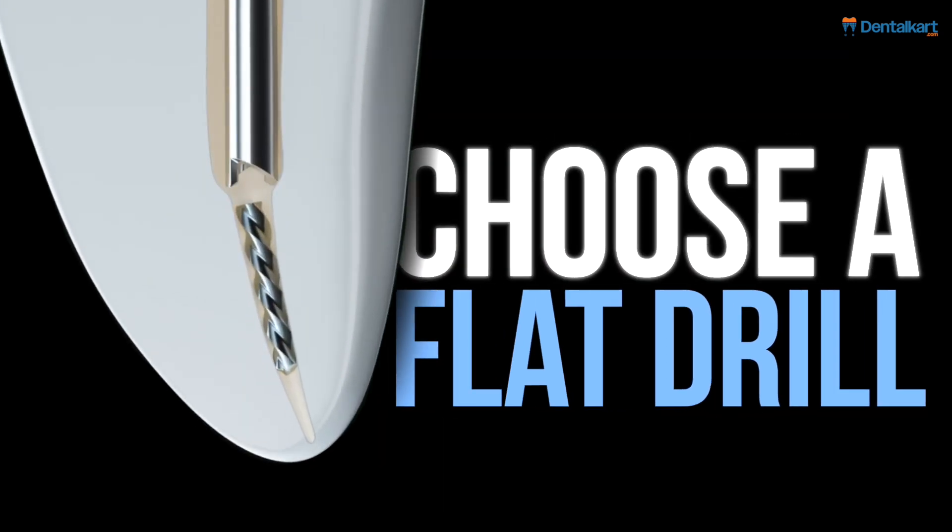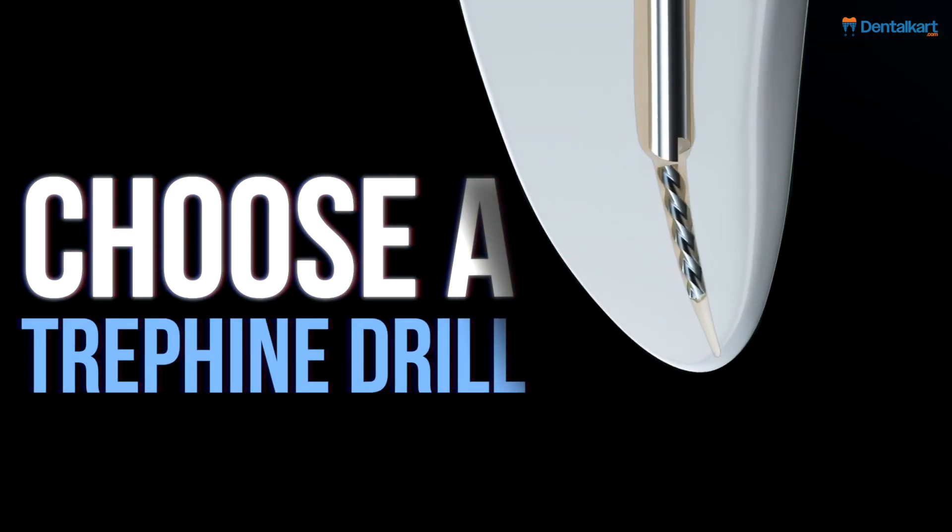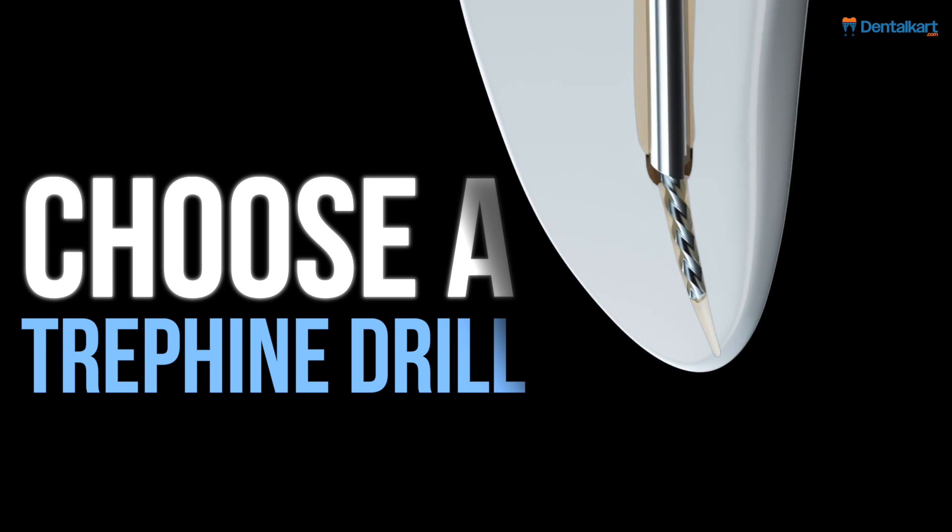Choose a flat drill to stage the coronal aspect of the broken file, rotating counterclockwise at 150 rpm. Then choose a trephine drill at 150 rpm to remove dentin around the broken file, exposing one to two mm while preserving tooth structure.